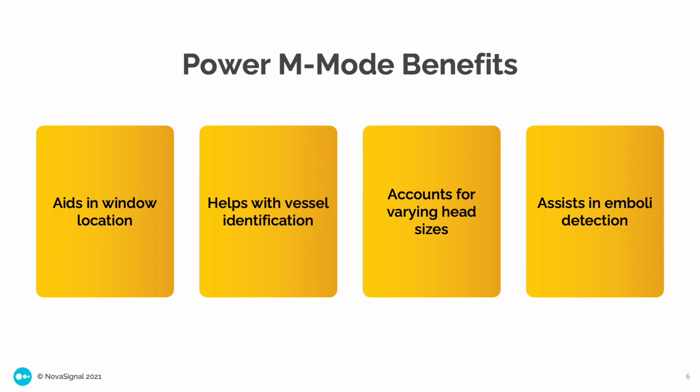It also assists in emboli detection. You can actually see the emboli within the M mode across multiple depths, not just one depth.